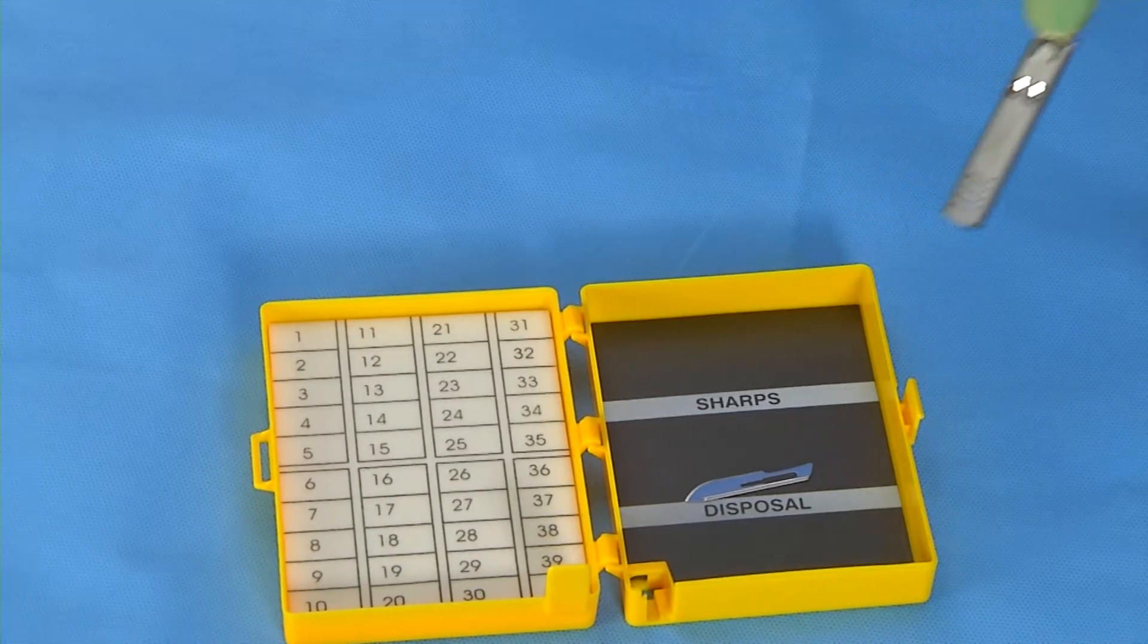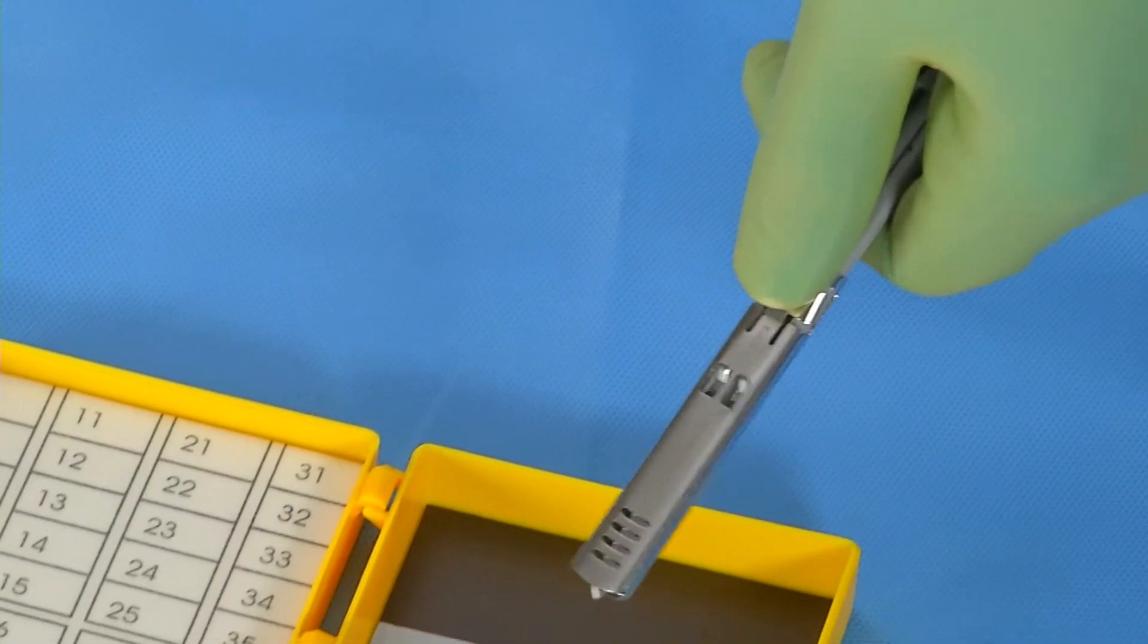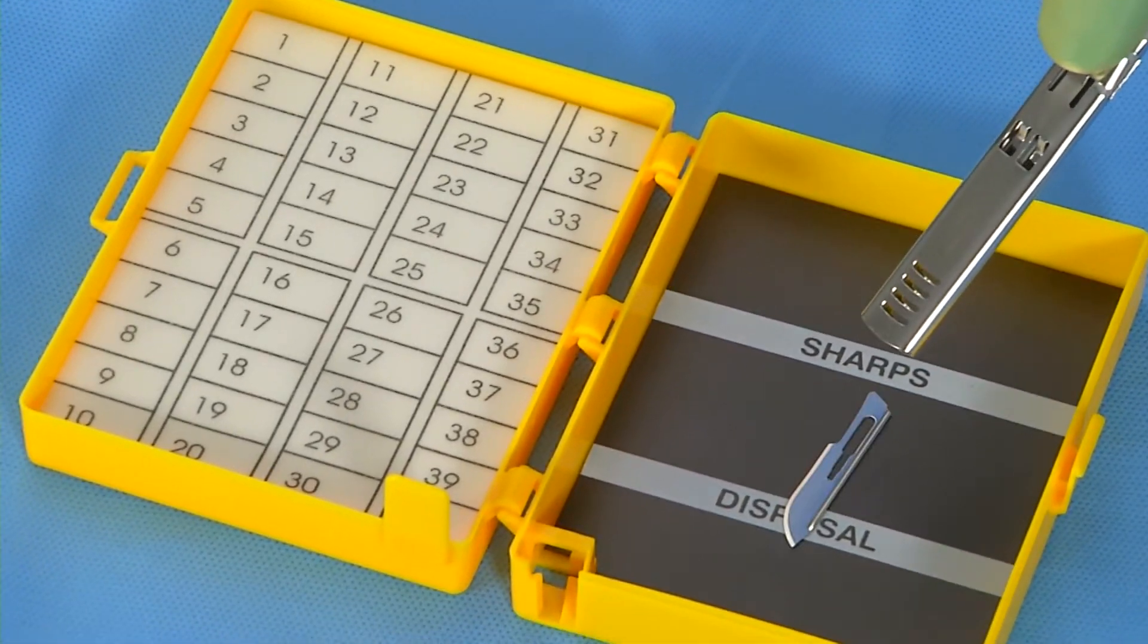To remove the blade with your left hand, move the shield forward and push the side locking button until the blade is released.